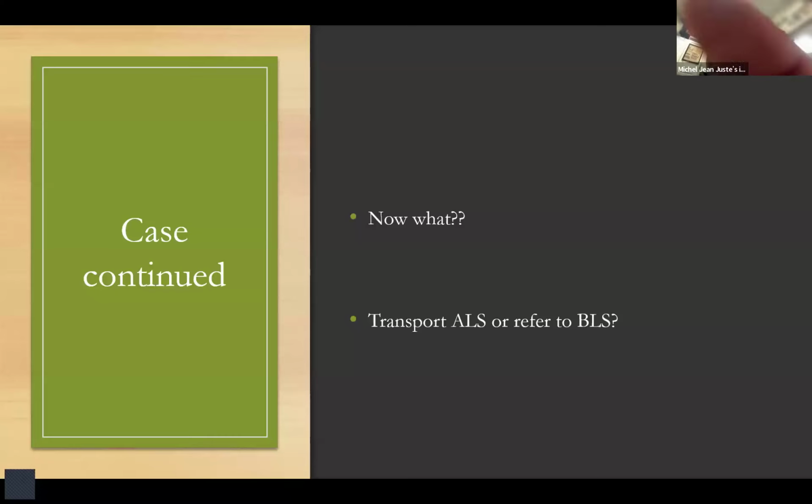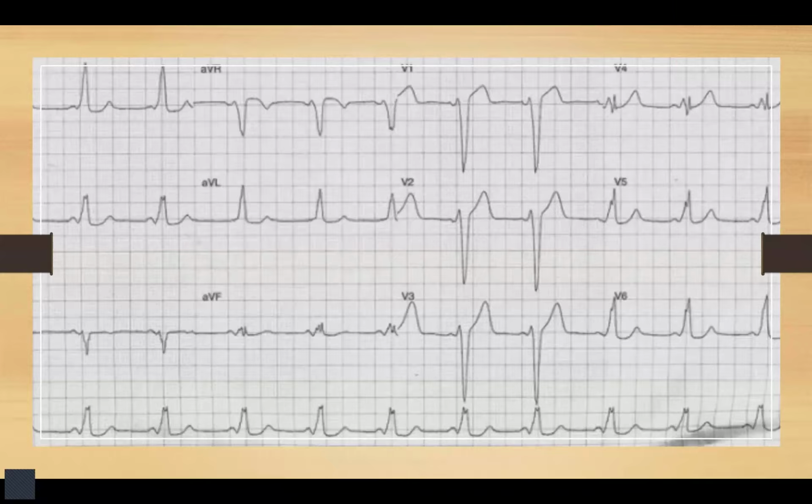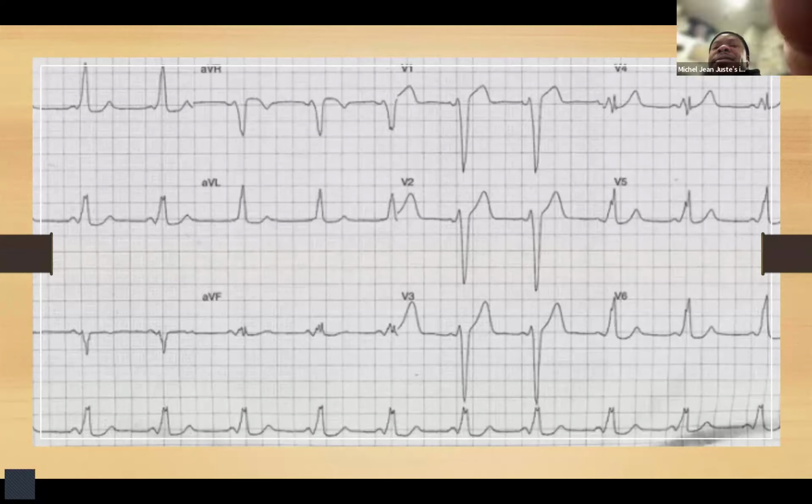Absolutely. Can I ask a question about that EKG? Yeah. Would the WPW be the cause of that LVH phenomenon? No, it's probably concomitant, so he could also have that LVH. Sometimes you can see increased voltage, although you don't really see it in every traditional lead, with someone with a really narrow, thin chest wall, just because you're picking up more stuff.